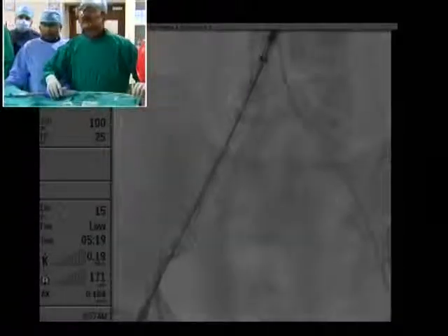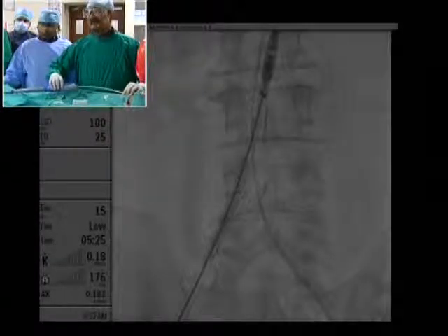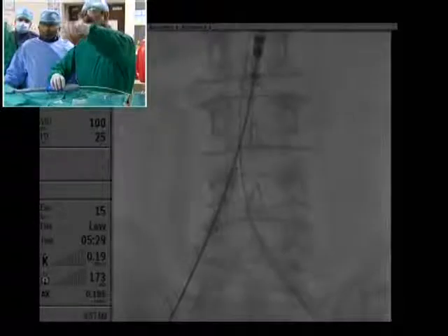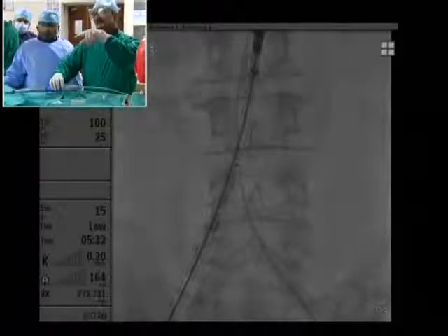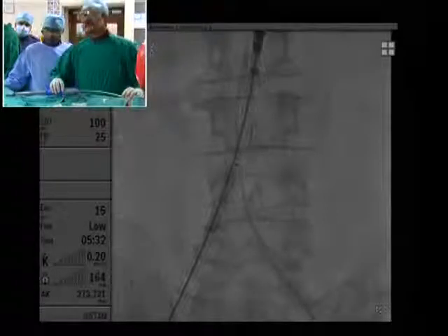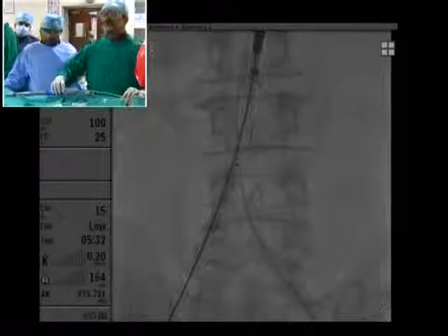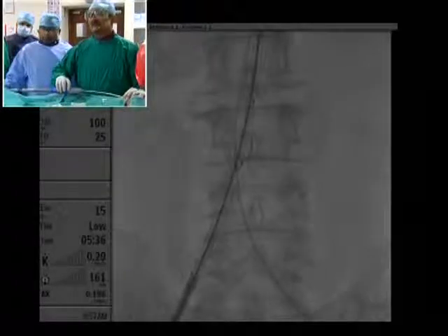I'm going in. As I go in, I have to make sure that the contra gate is pointing to the left side. So let's have a look a little lower down. We're coming in and there's a black dot which identifies the contra gate. There are two black dots in the middle of the device. The lower one is the lower end of the contra gate, and the top end is where the main body divides. So I'm keeping that lower middle one pointed a little to the left. So you can see that's pointed to the left.